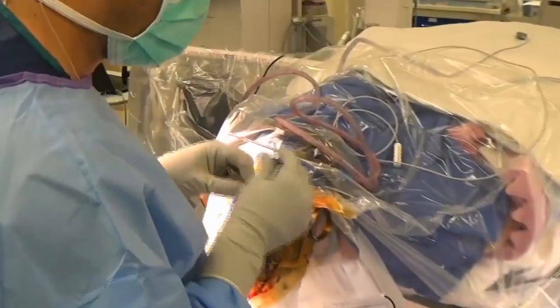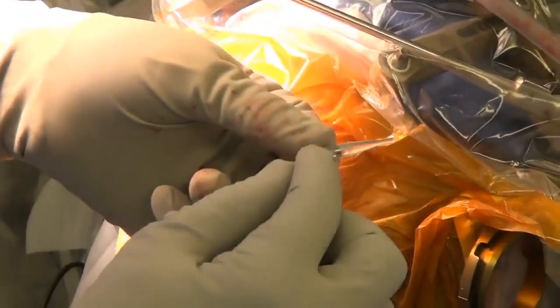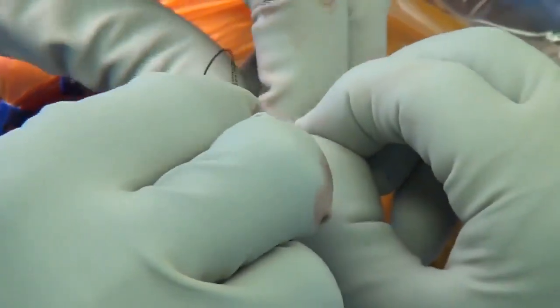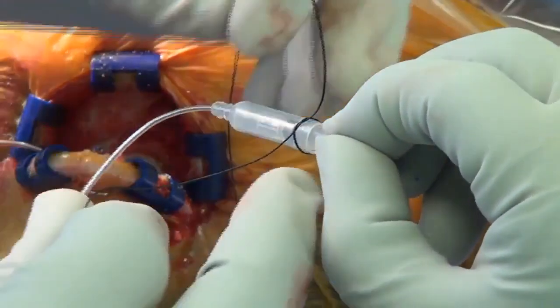So this little thing I'm putting on here, we call it the boot cover. It's basically a covering of the electrodes. You can actually see 3 of the electrodes right here, and the 4th one is being secured by the boot, and that's the tail end. I'm going to remove this in a couple weeks, and that's where I'm going to connect it to the secondary wire, the extension that goes down the neck to the chest, where the internal pulse generator, the pacemaker, is placed.